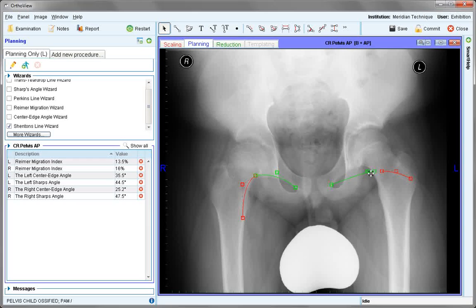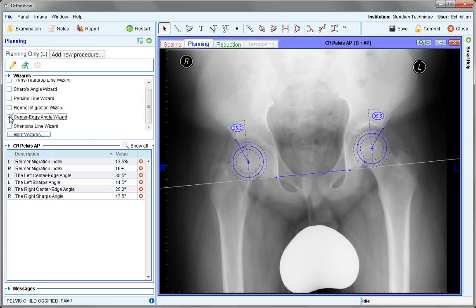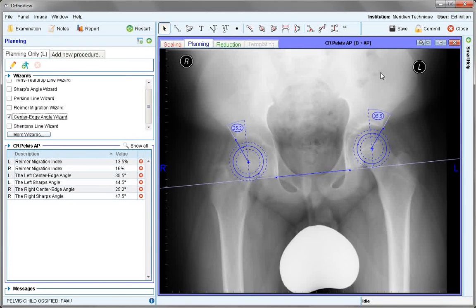Alternatively, just use a single component positioned to the curvature. The second tool can also be used in some cases for measurement of the curvature of the external pelvis shape. Whichever wizards you would like to appear on the saved report, add those to the screen — such as centre edge angle — and then go to save or commit. This ends the tutorial on assessment of DDH in the child pelvis.